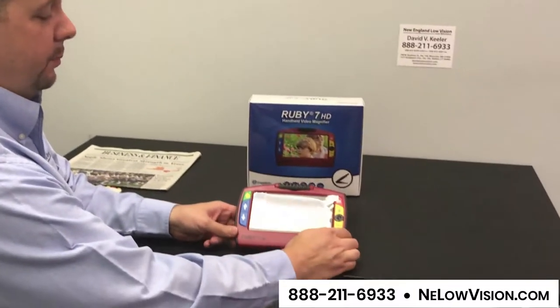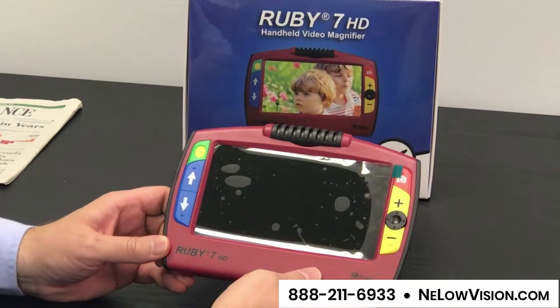My name is David Koehler and I'm with New England Low Vision and Blindness. Today we're going to spend some time with the Ruby 7 HD. The Ruby 7 HD is a portable video magnifier made by Freedom Scientific.